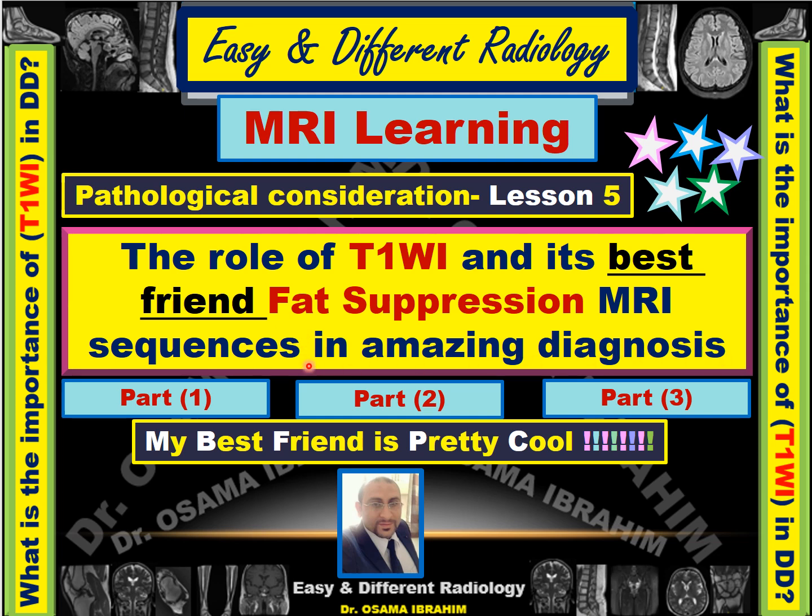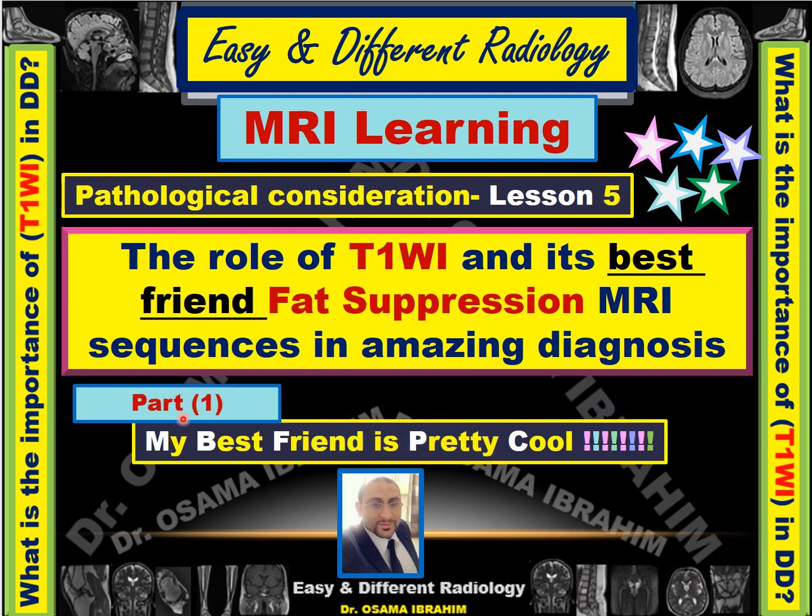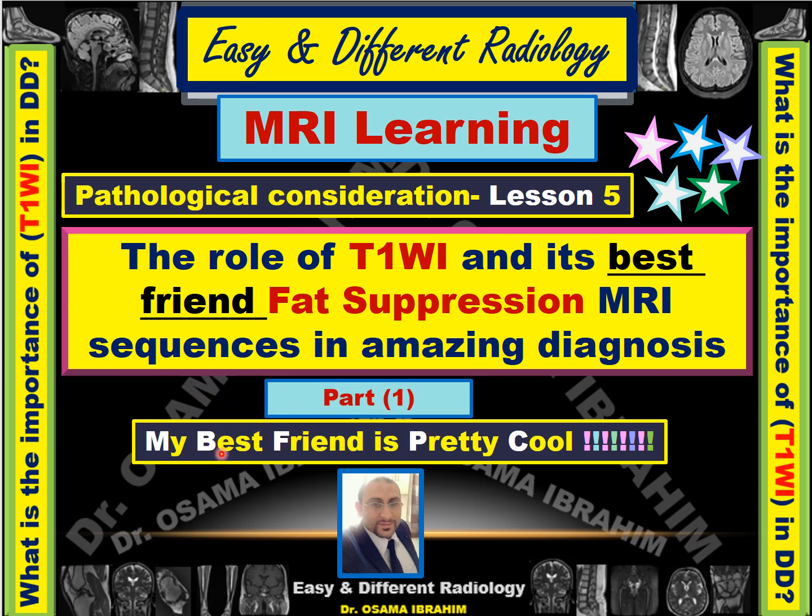Actually, I decided to make this presentation in 3 parts. Today, I will talk about the first part. In the first part, my best friend is pretty cool. What is this? Let's go through my presentation to know what it means.